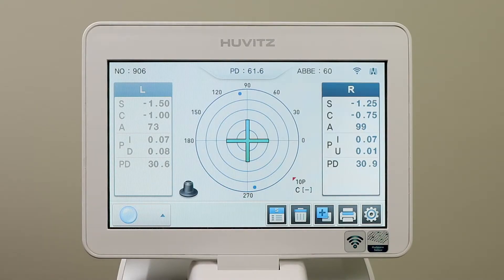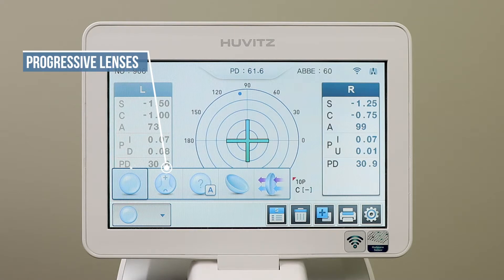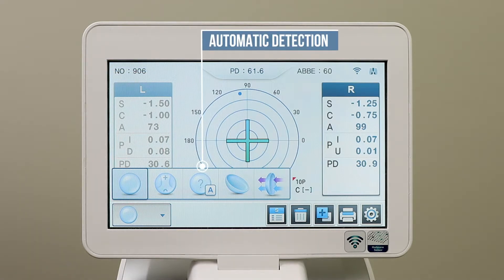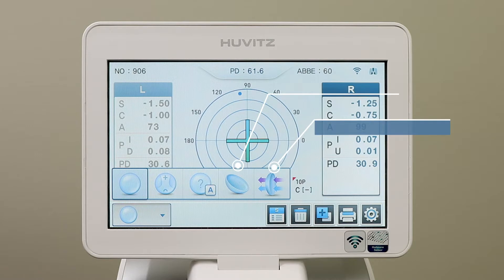The Hoovitz Auto Lens Meter screen is very easy to read and requires little training to use. In the lower left corner is a menu. Press the button to read single vision lenses, progressive lenses, automatic detection between the two, hard contact lenses, and UV and blue light hazard detection.